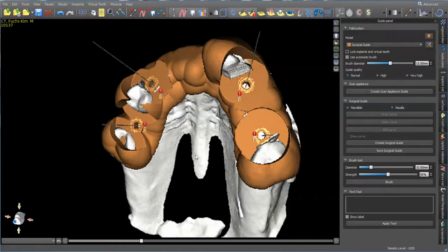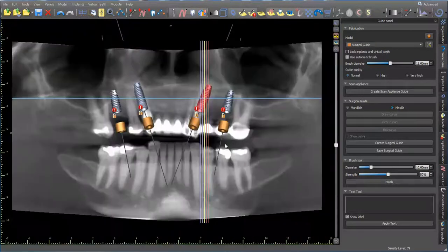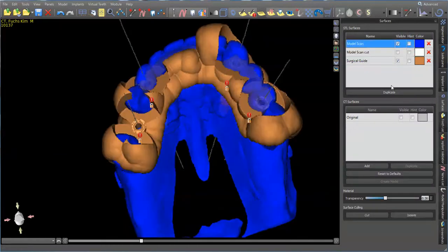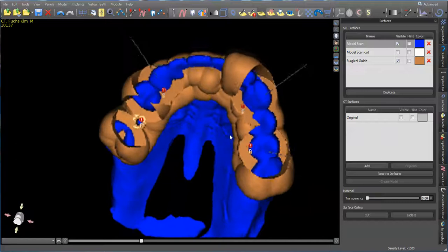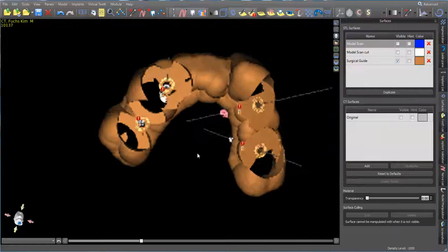Now that looks a little close, so I'll go back in and look at that. Make sure I'm far enough away. And I can even turn back on this. Let's go to surfaces. Change the translucency out. So yeah, it's coming out the central fossa. So that's going to be good. So it looks good. This is our surgical guide that we'll use for our case.